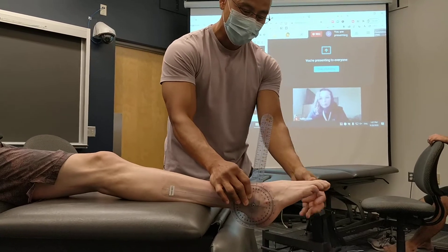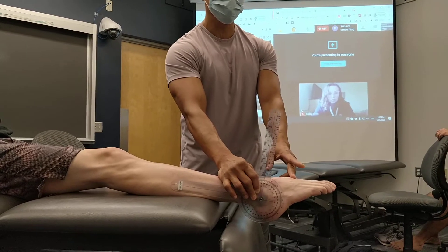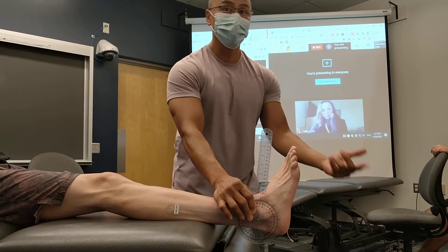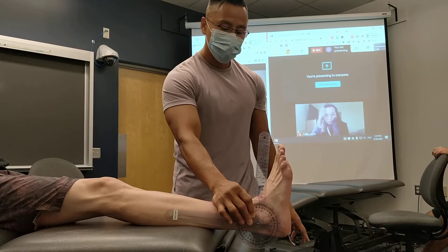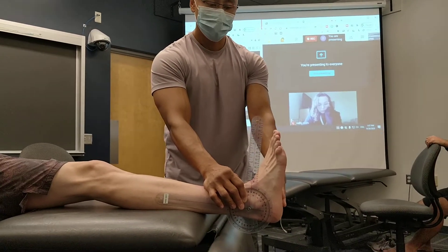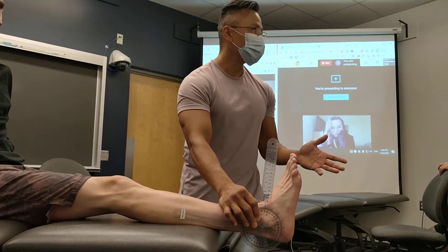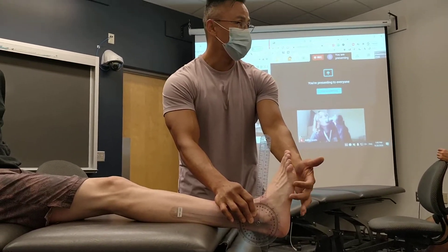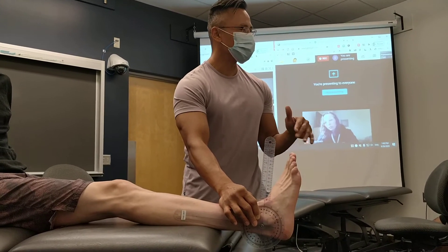When we plantar flex and there's that curve, it kind of throws you off because now you're looking at motion between the hind foot and the mid foot. If you use the curve of the mid foot, it adds a few more degrees. People from PT schools were starting to use the surface of the calcaneus. A lot of people use the shaft of the fifth, but the shaft could go a little further. So most people — I tend to teach you to use the base of the fifth because there's not much movement at the base.